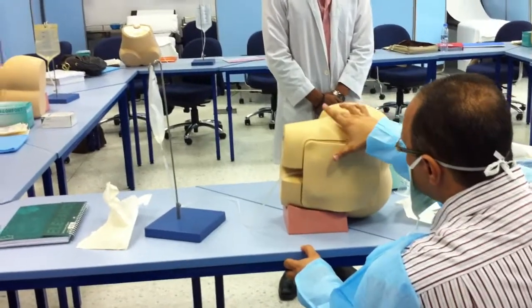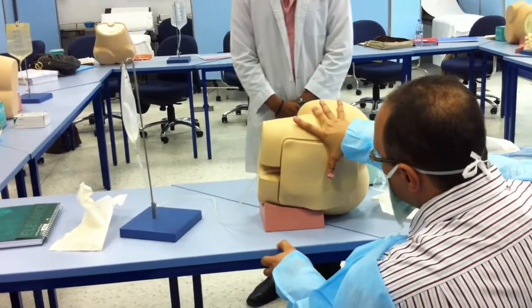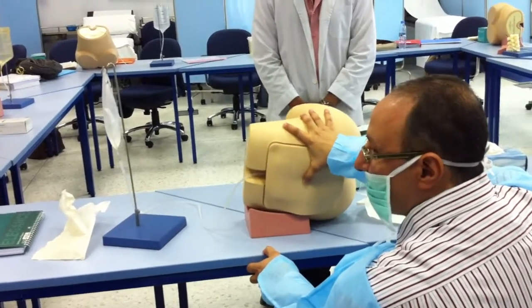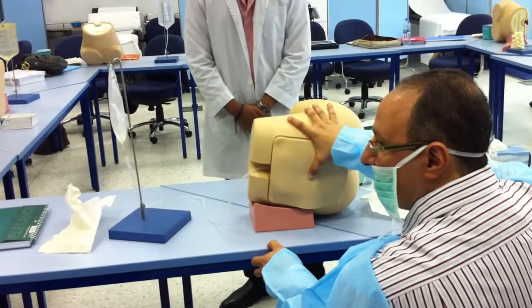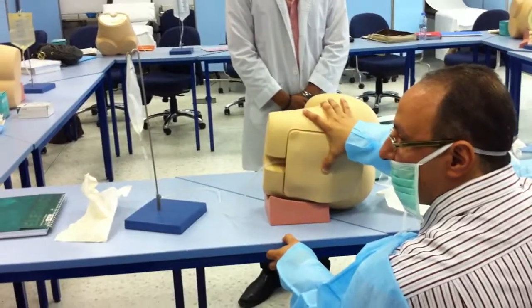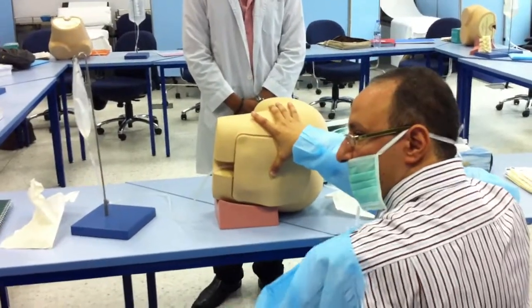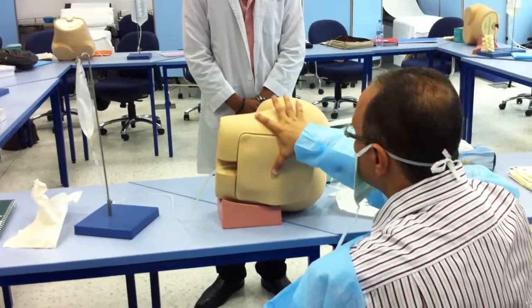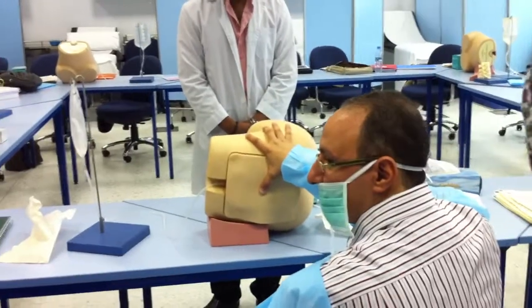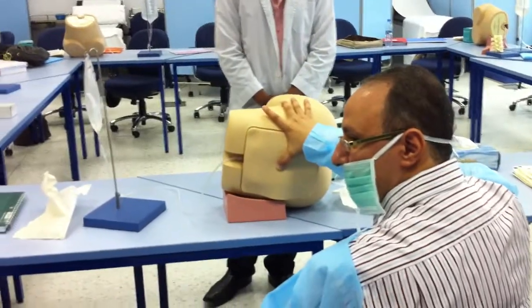I'm going to feel the iliac crest, and with my thumb I'm locating the space opposite to the iliac crest. This space is equivalent to L4-L5 — the space between L4 and L5. You're feeling the iliac crest with the middle finger, and with the thumb I'm feeling the spine.